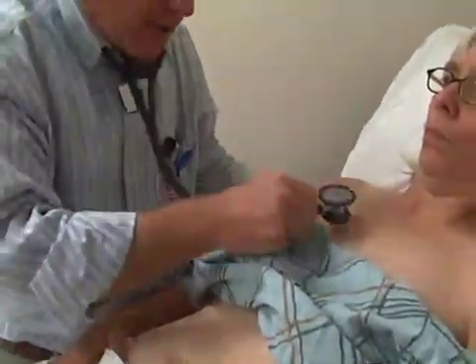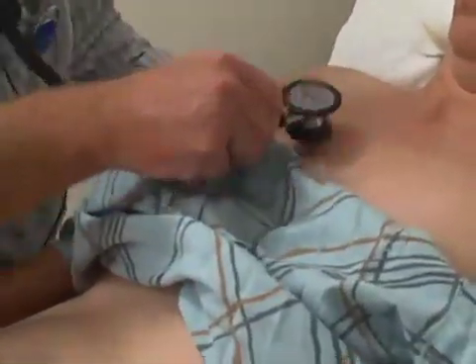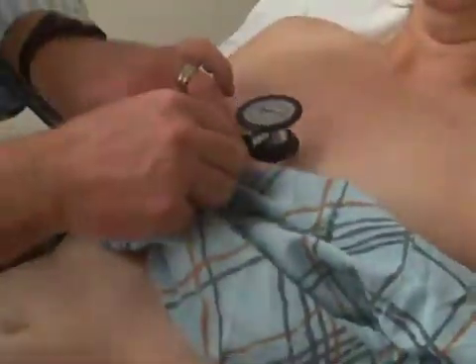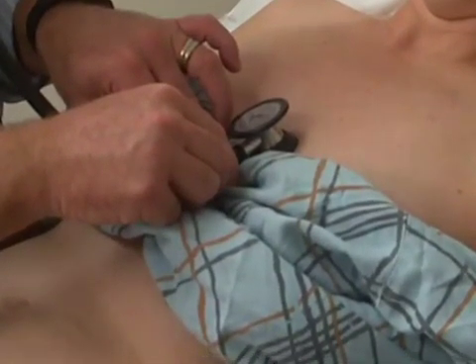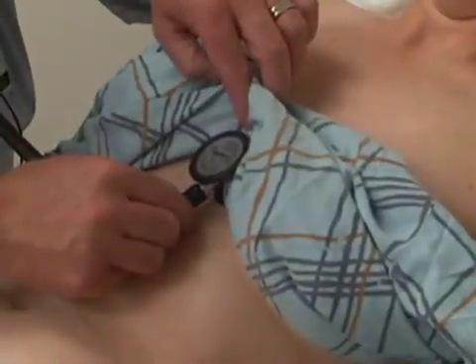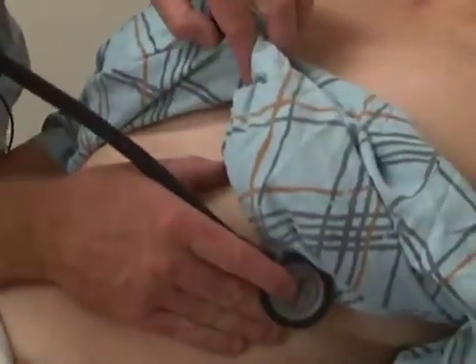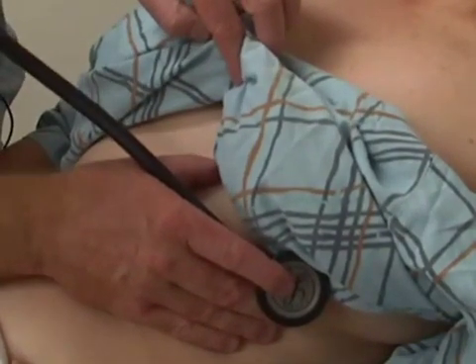And next we go back and using the bell to hear the lower frequency sounds. We listen in the same areas. Right second costal interspace, left second costal interspace, the tricuspid area, and about the 4th interspace, and the lower left sternal border, and then over to the apex of the heart at about the 5th costal interspace.